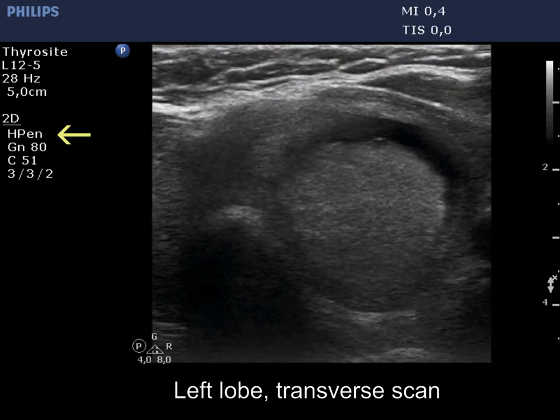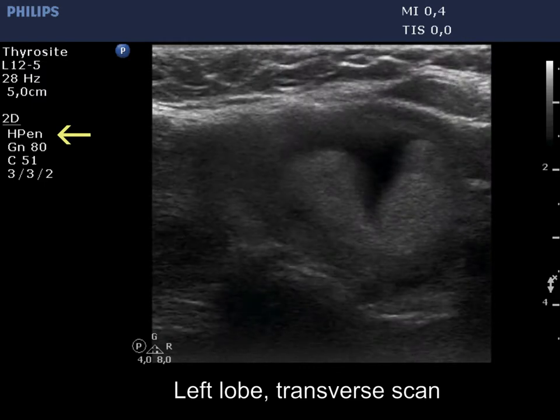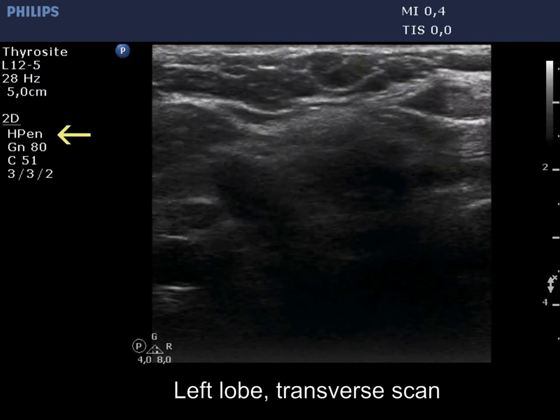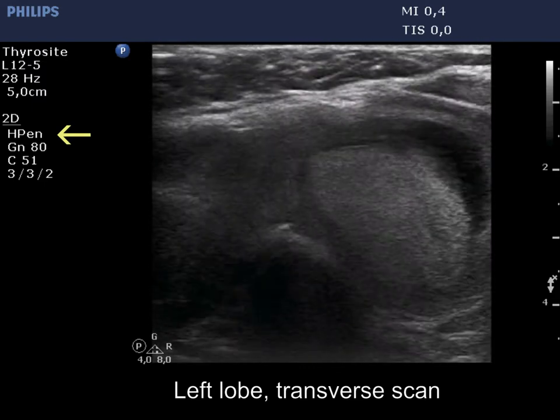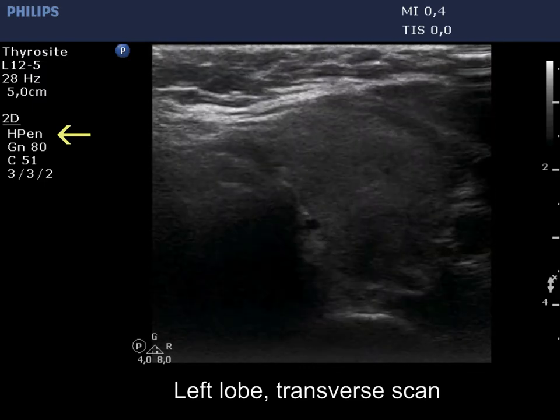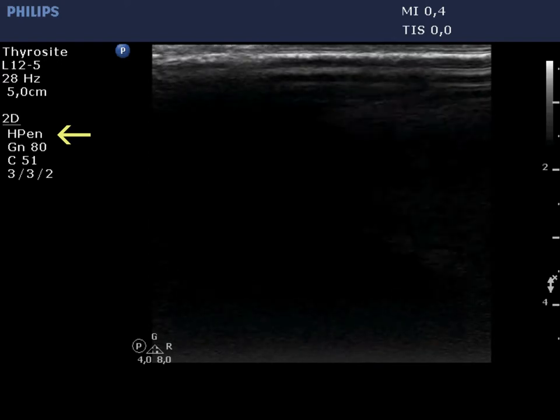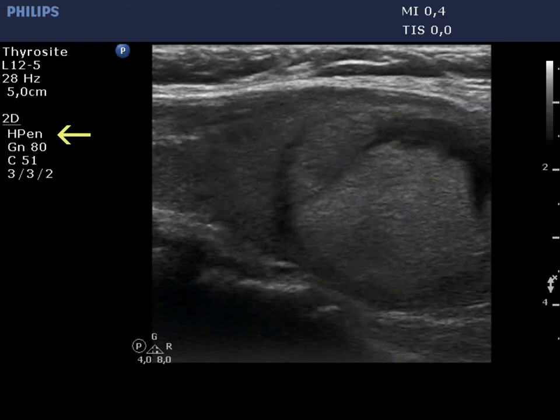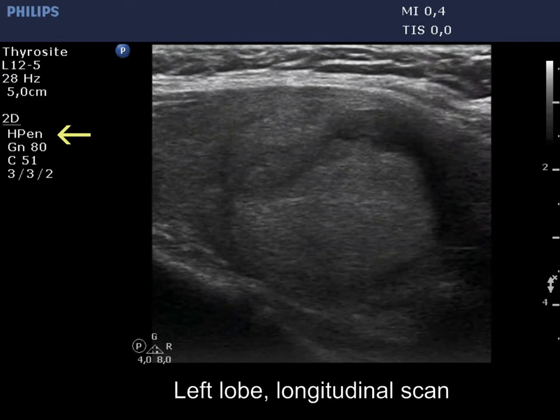Now, we change the settings to better penetrance. The lower pole is just visible.